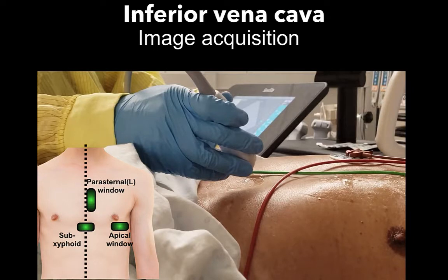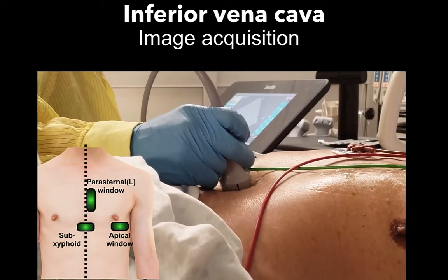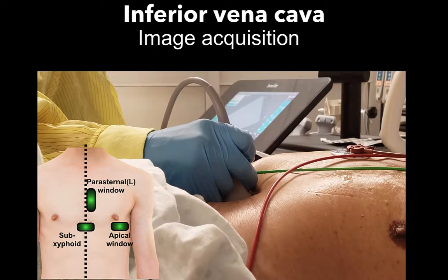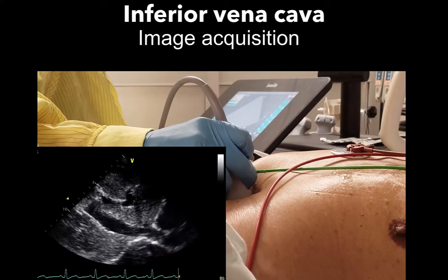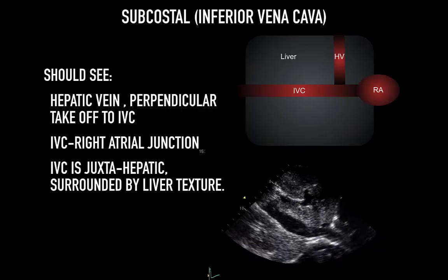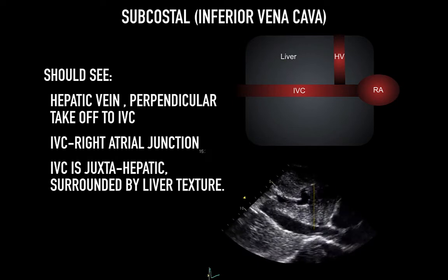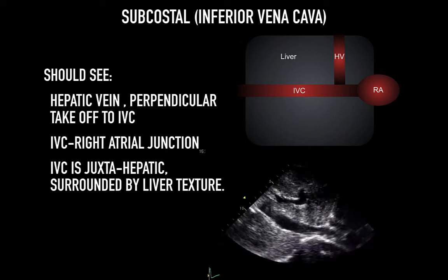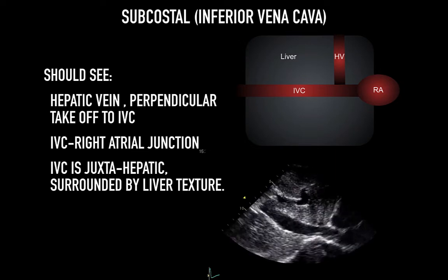Moving on to the inferior vena cava view, obtained just below the xiphisternum to the right of midline. The probe should be pointed towards the head, or cephalad, with the planar cut following the parasagittal or sagittal plane. Start gently, as it often doesn't require a lot of pressure — just some finessing. With some gentle rocking, looking upwards with the tail falling downwards, you will easily see the entrance of the IVC into the right atrium. You can see the IVC coursing beside the liver into the right atrium. To properly identify the IVC, you should see the hepatic vein, which is perpendicular to the IVC. You should also see the IVC right atrial junction and recognize that the IVC is juxtahepatic, surrounded by liver texture. The aorta does not connect to the right atrium and is often surrounded by hyperechoic mixed-density fat.